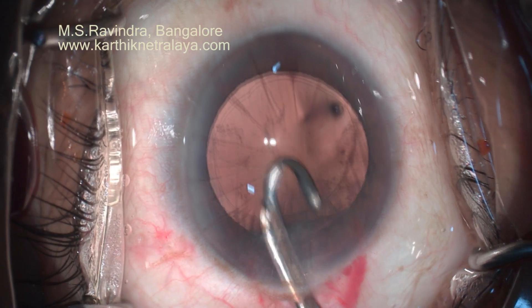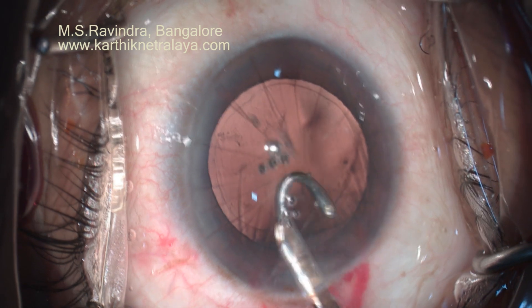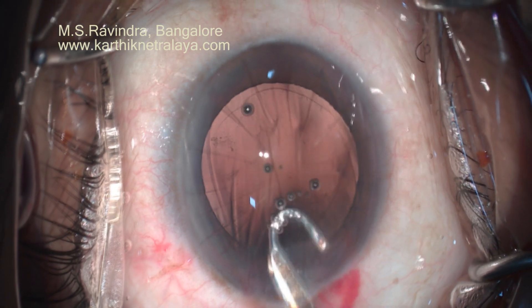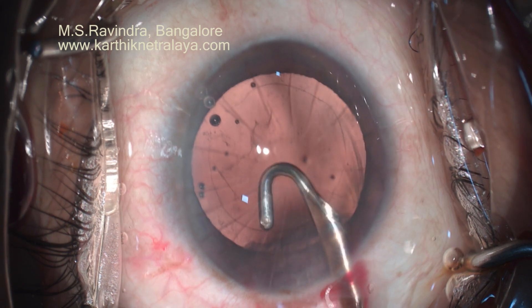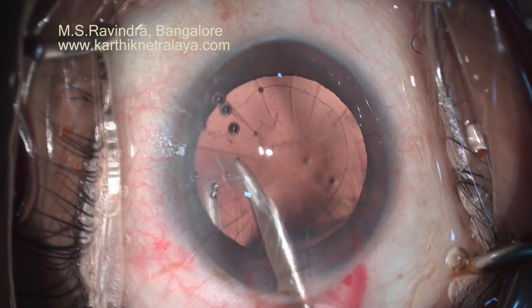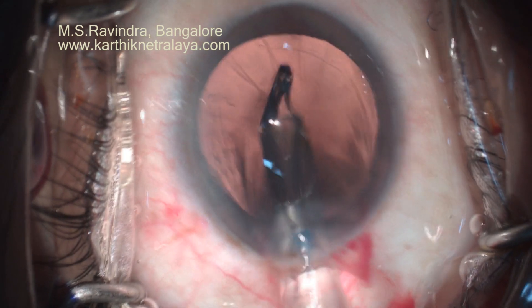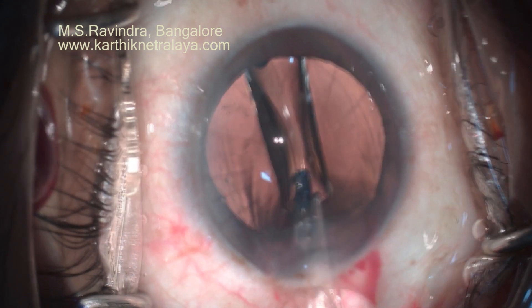The lens is implanted with a slit cartridge technique. In a myope, I usually plan to target around -0.5 or -0.75 diopters so that they have good intermediate vision.